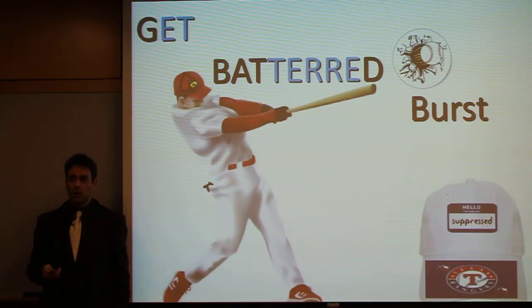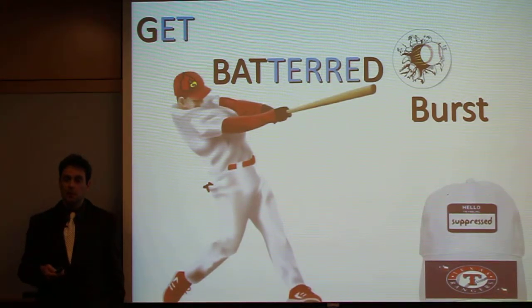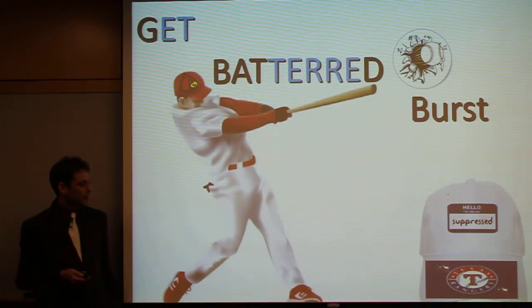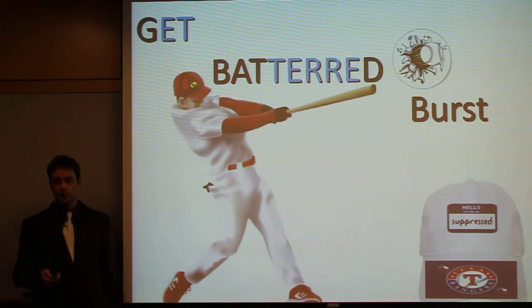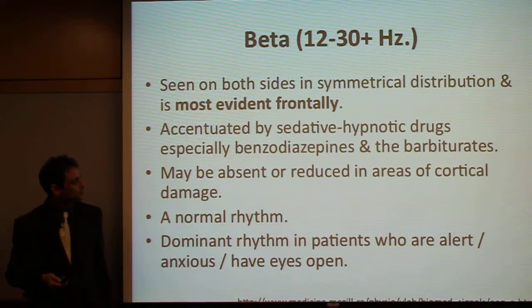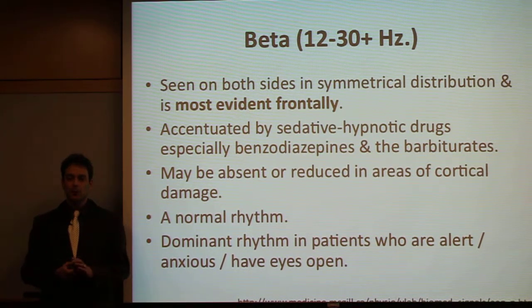Burst suppression does not occur with physiological sleep or physiological states, but may be seen in coma and in general anesthesia. And then persistent suppression or isoelectricity is also not seen physiologically, but may occur with very deep anesthesia or deep coma states.